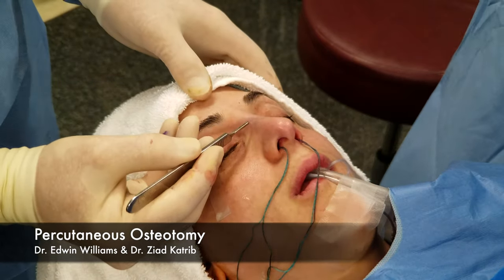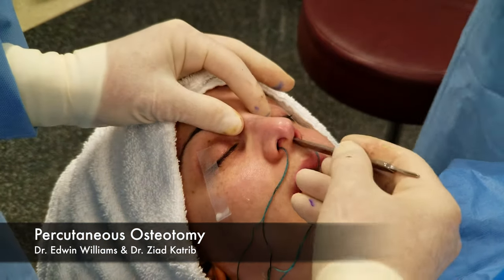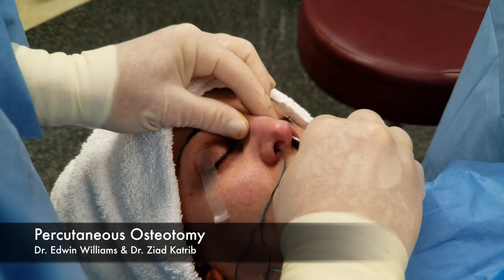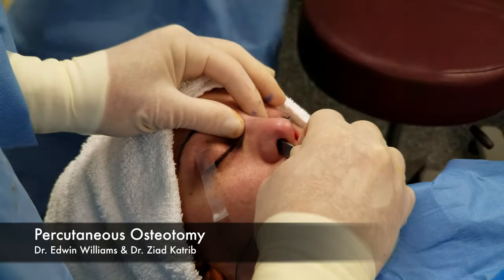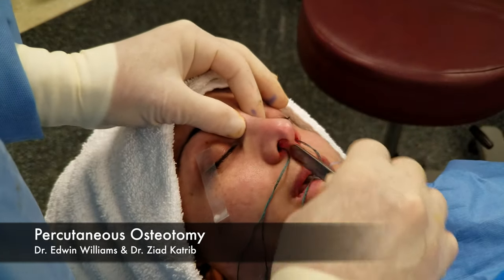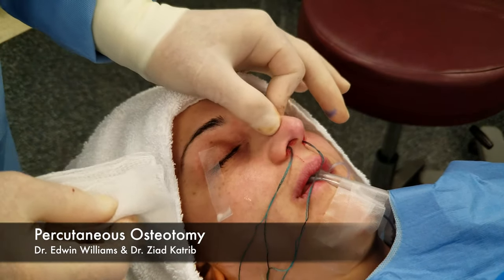The osteotomies have come about 45 degrees off the midline and then low. You can feel that the nasal bones are mobile — that side's nice and mobile, this side's mobile. However, there is one little spicula bone up high that's just holding everything.